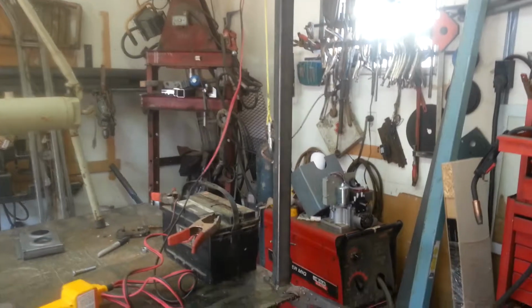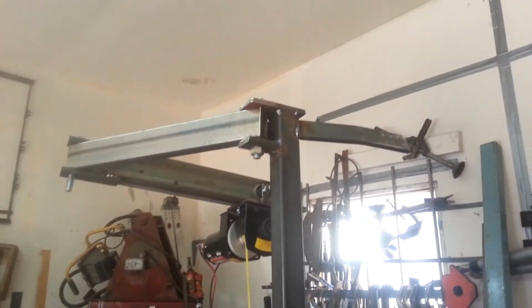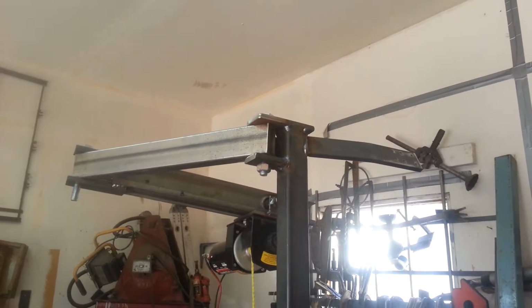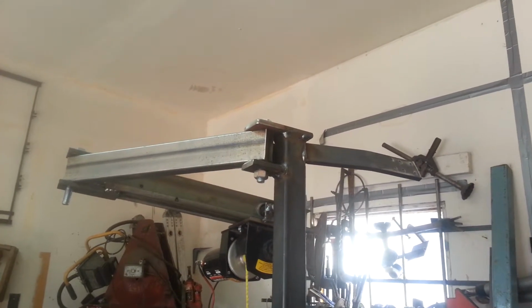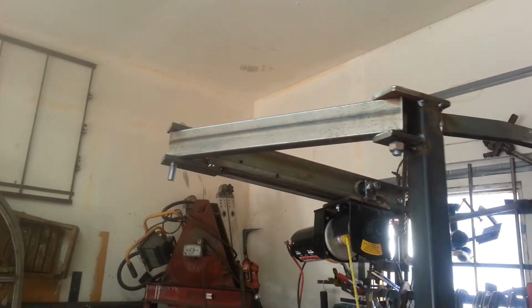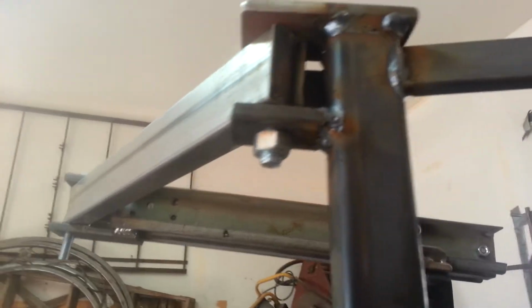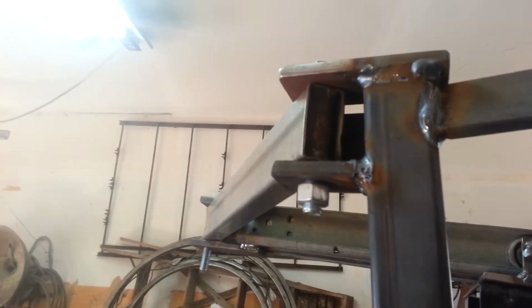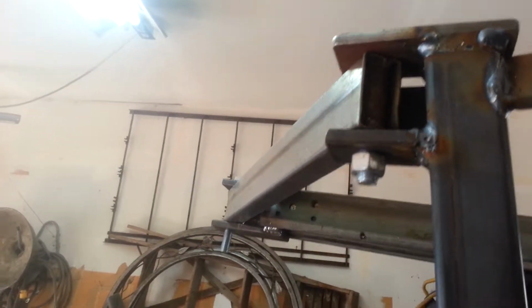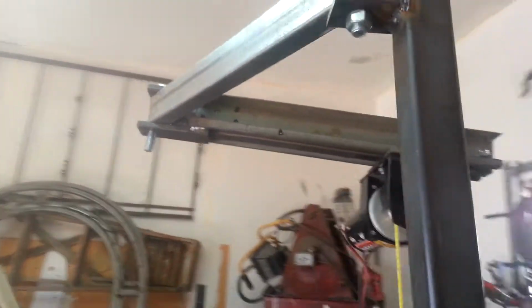The main post of it is 1.5 inch, 100 wall square tubing. It's got a bracket that I fasten to the ROPS structure, and then I'm using 2x1 tubing, .065, in which I have sleeved the ends where the bolts go through, the pins, and it bifolds. Right now it's in the travel position.